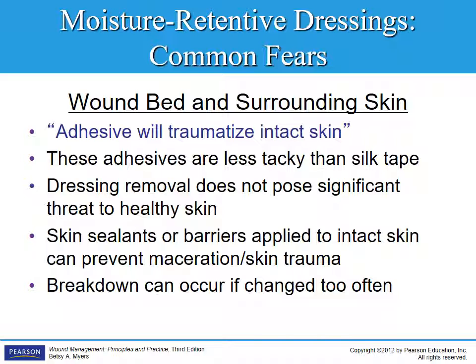And the other thing is that breakdown can occur if it's changed too often. Remember we talked about a moisture retentive dressing not being changed as often. So it's not like you're ripping this adhesive off the skin 2 to 3 times a day. You really aren't. But if someone does have a reaction to an adhesive, or if there is a changing of the dressings multiple times a day, then yes, the surrounding skin's probably going to be traumatized. But if the moisture retentive dressing is used correctly, there should not be trauma to the intact skin.